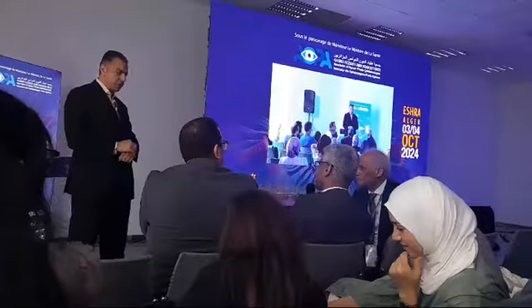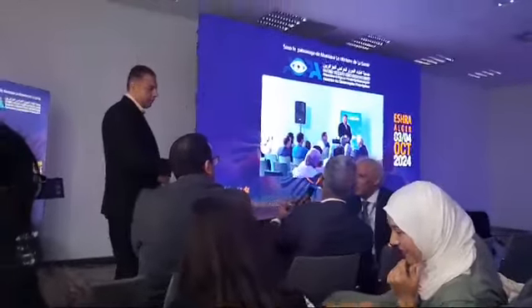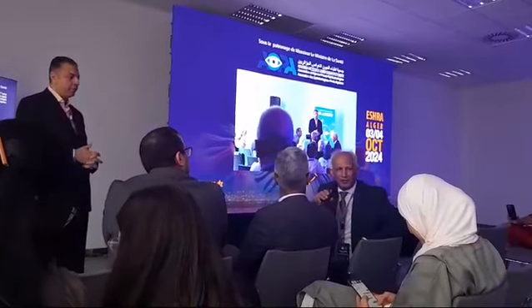So we have to check the elevation map before to detect earlier changes. Also, if someone had decentered ablation, you may misdiagnose it as keratoconus. Decentered ablation may look to you like keratoconus. So if the posterior is raised, it always means ectasia. Anterior is sometimes a bit borderline.